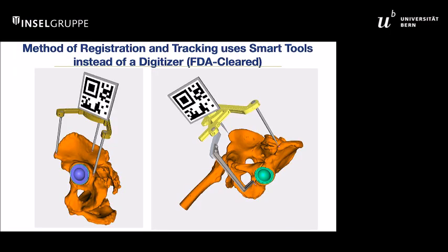The way that we typically do it, and this is the way that is being used in the United States routinely now, we have smart tools that dock to the patient on a predicted method, and if we know exactly how a tool is going to dock spatially on a particular patient, we can predict also where that image tracker is on top of that tool, and then we can do the math to project so that when the camera sees that image, it can project the information into the patient in the correct location.